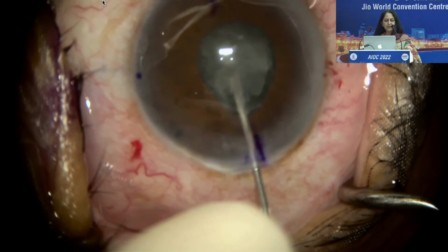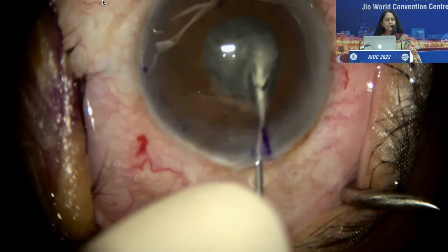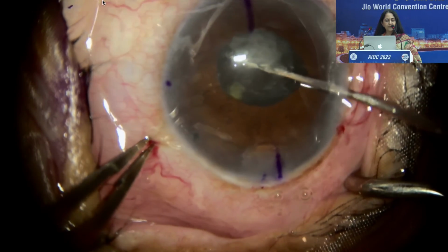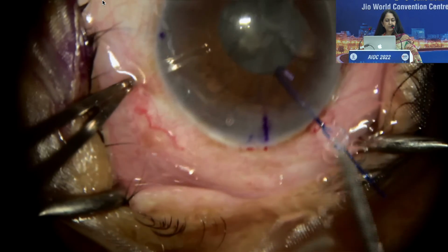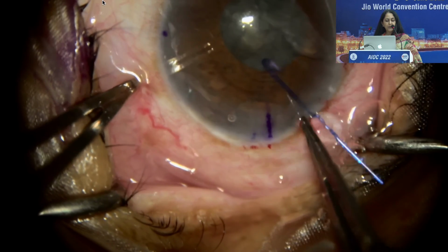It's very important in these cases that we see that the nucleus is mobile. Take a minute or two to do this maneuver, because this is your end result. If your lens has moved and is rotating easily, then things get easier. Since this was a case of toric IOL, we are putting in these hooks.